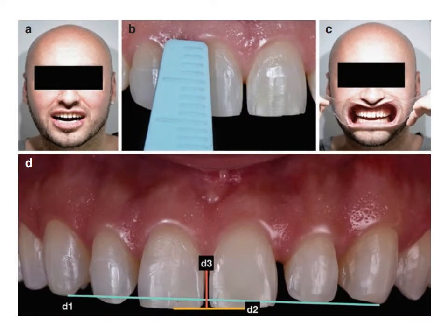Digital design consists of first performing a digital facial and dental analysis on which the horizontal bipupillary, nasal, and labial commissure lines are marked, along with the smile line. Digital design on two-dimensional smile photographs should take into account three important issues: the size of the photograph, to correlate the extraoral photographs with intraoral ones, the parallelism of the photo with the horizontal plane, and the position of the incisal edges and the position of the midline.